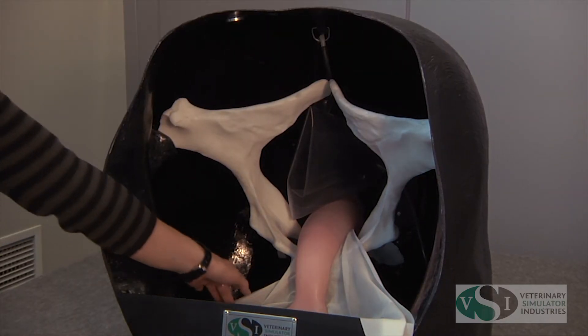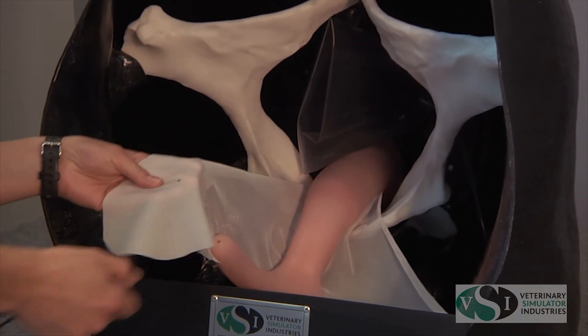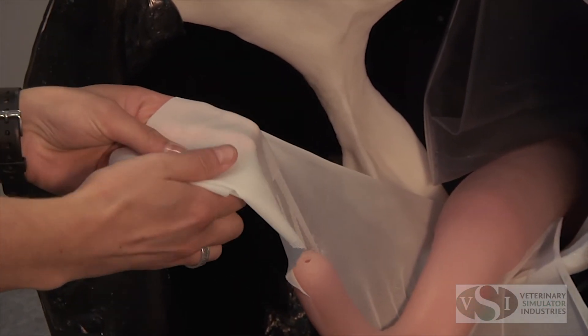The uterus model is kept in place using the magnets provided. Place the magnets underneath the broad ligament and connect to the magnet plates on the body wall of the model.